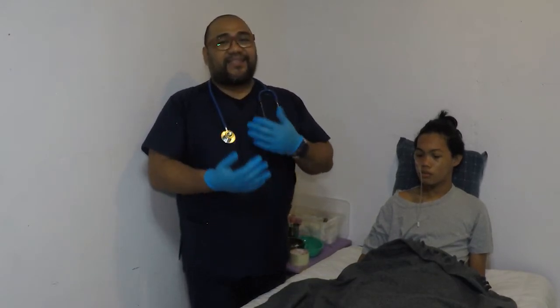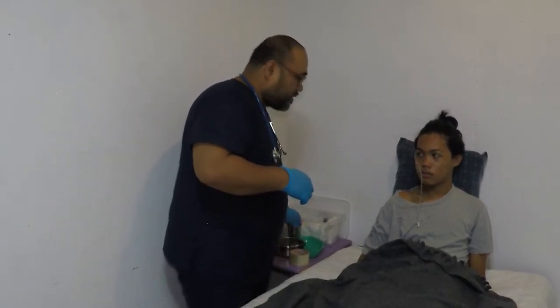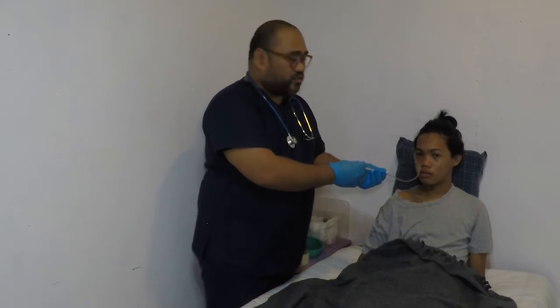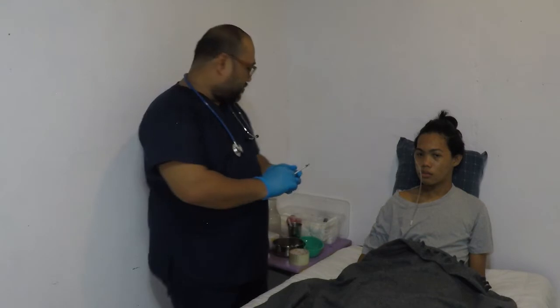Then determine the placement of the feeding tube by aspiration of the stomach secretion. So we have to aspirate the stomach secretion, then inject 10 to 20 milliliters of air into the tube. Then an X-ray or ultrasound may be needed to determine the tube placement if needed or if possible.